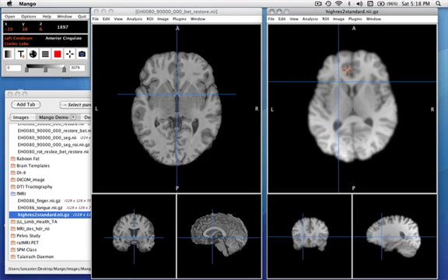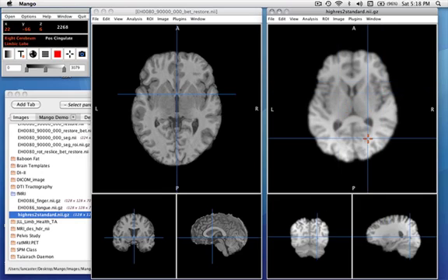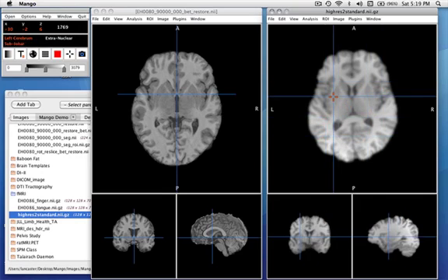So just like the image on the left, we see, as I point around, we get the Talairach labels from the various structures, and it's moved the cursor, it contains the slice locations as well.